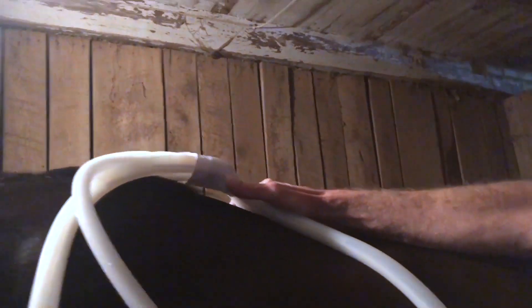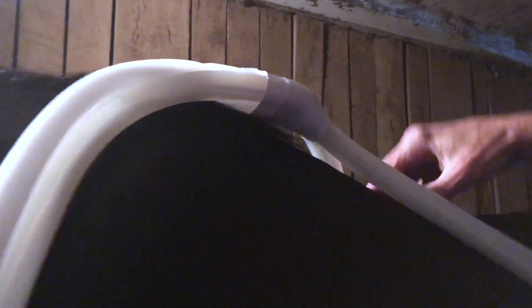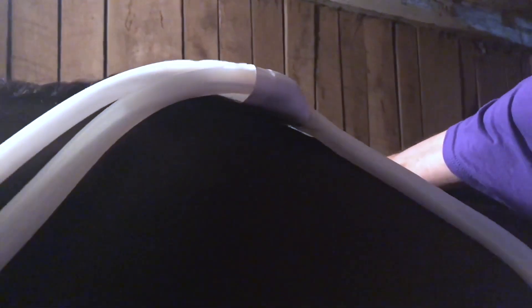What are we doing with the green button here? That's the start of it again — it's got a timer that only goes 10 minutes. And now we've moved it. See right where that sits there — I can do the withers and everything. I kind of go like this and hold this other end up for the shoulders.